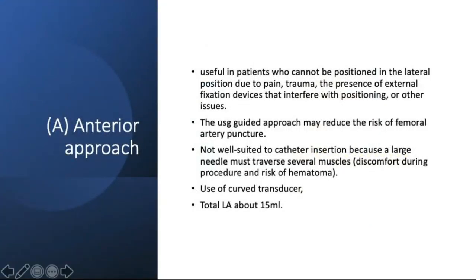Firstly, the anterior approach is useful for patients who cannot be positioned in the lateral position, due to pain, trauma, or any external fixation devices. The ultrasound-guided approach may reduce the risk of femoral artery puncture, but it is not well suited for catheter insertion because of the large needle and the depth. For this approach, we need to use a curvilinear transducer.